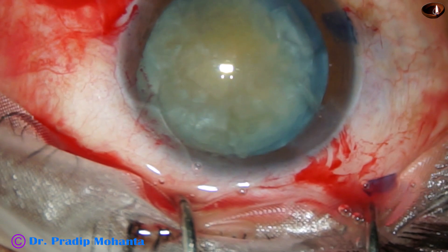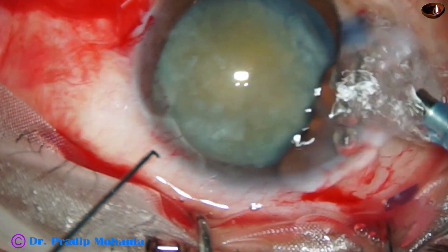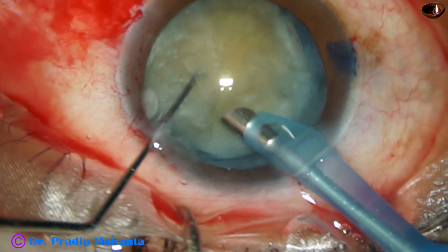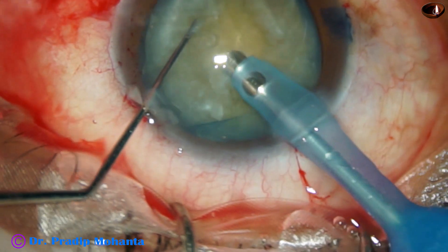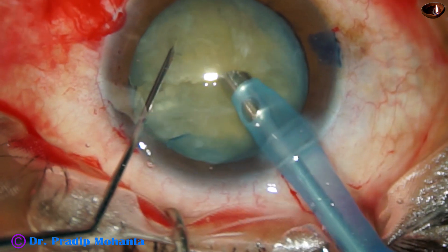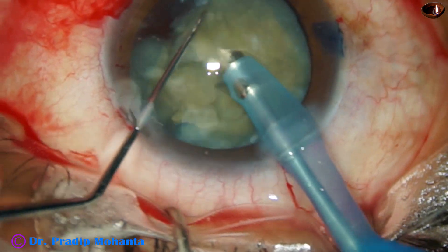I ask for the phaco handpiece and adjust the bottle height. Usually my bottle height is about 130 cm; I brought it down to 100 cm. I also decreased the vacuum and flow rate a little bit, then started chopping and emulsifying the nucleus with the bevel sideways.